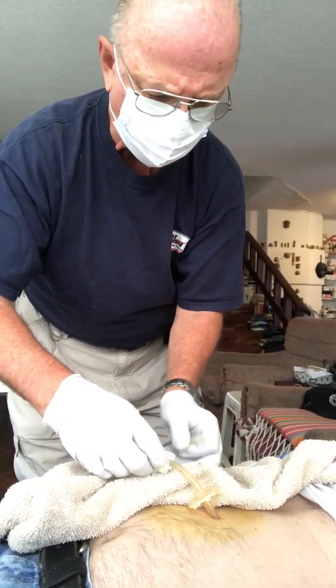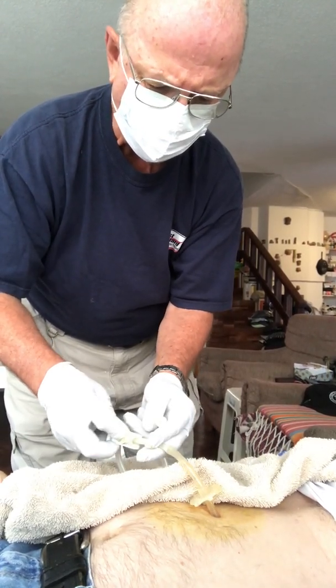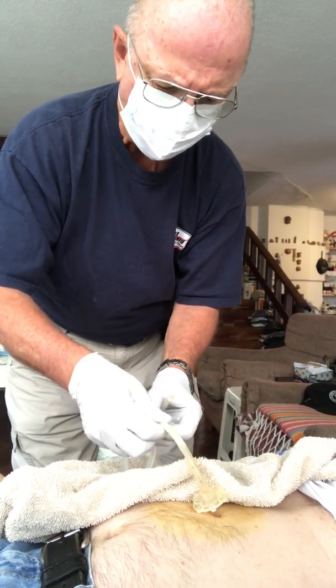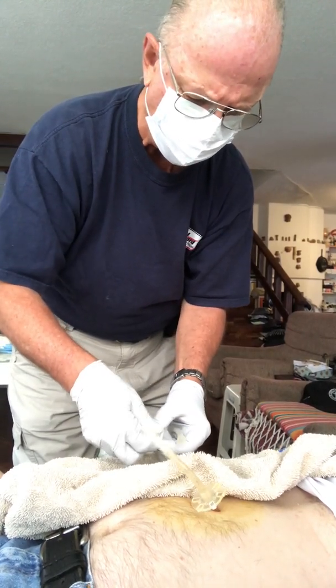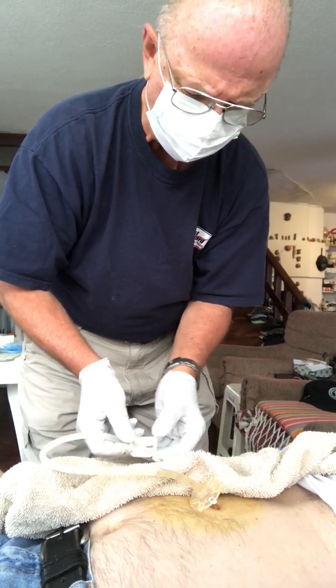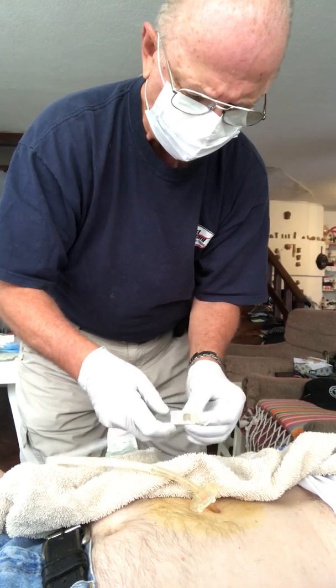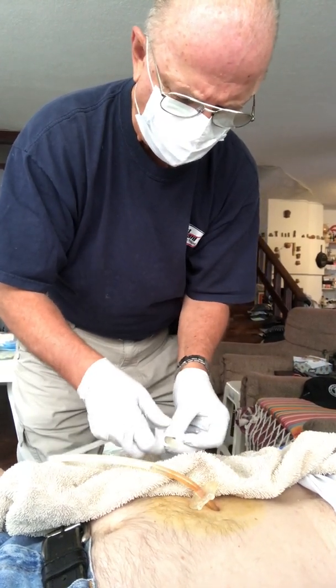Here comes the fluid. Now, okay, yeah, that's why I wanted the. You need an extra hand? No, it's okay. Just need to. Because it's pressing on the tube and forcing the fluid out. Okay. And a little line. Yeah, that's why I wanted the towel.